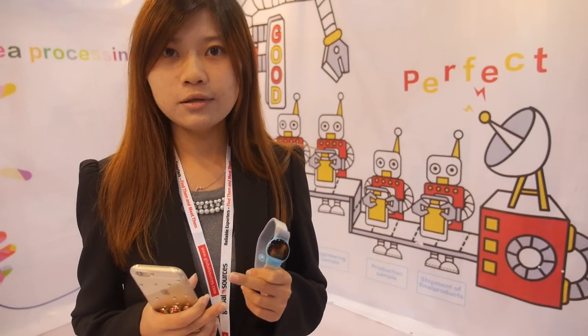What's the price and MOQ? The price is about 8 US dollars based on an MOQ of 5,000 units. Do you already have big orders? This is our latest product and right now we are in promotion.